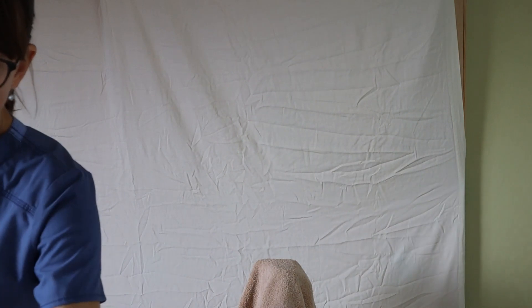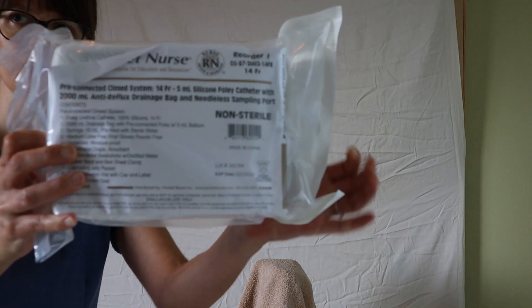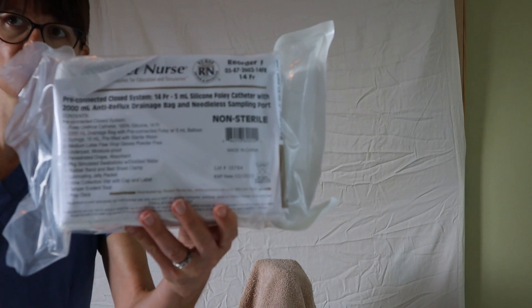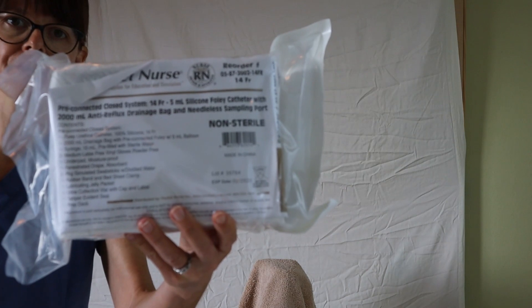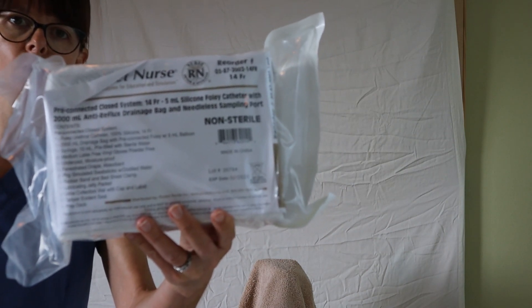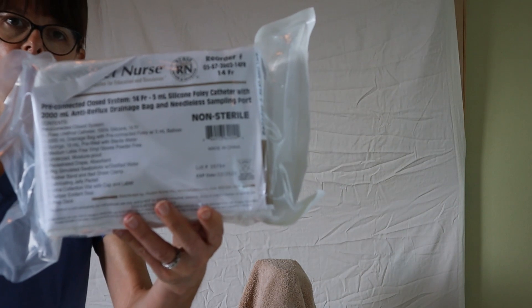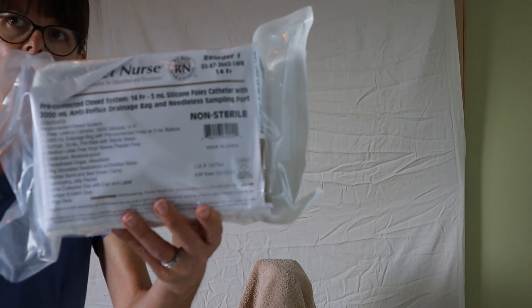Our catheter kit will always come with a label telling you the contents of the package. Make sure that you check beforehand if the patient might be allergic to latex or iodine, because the catheter itself sometimes contains latex, or the cleaning swabs or solution that the kit comes with contains iodine. If that happens, make sure that you consult with your policies and procedures and switch those items accordingly.